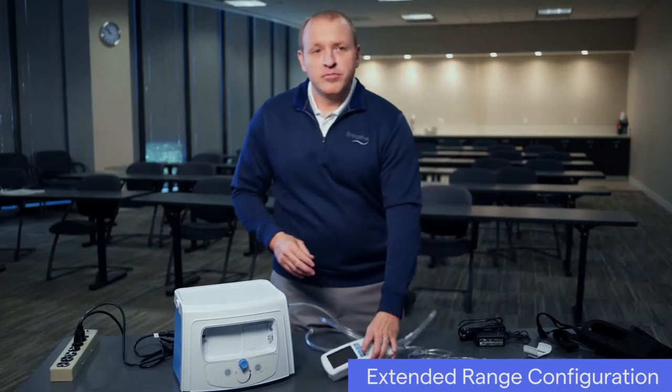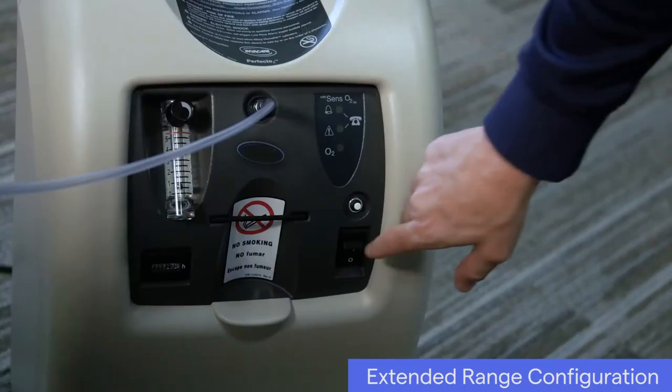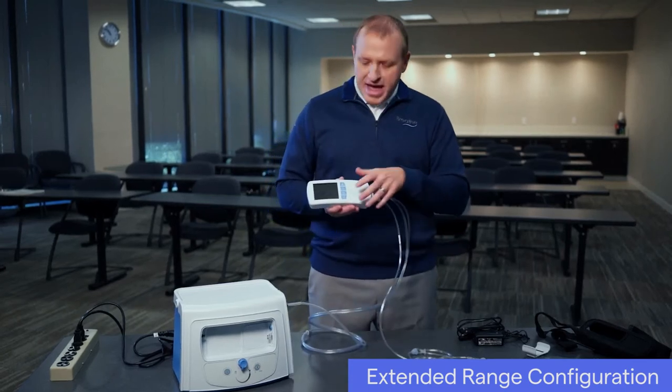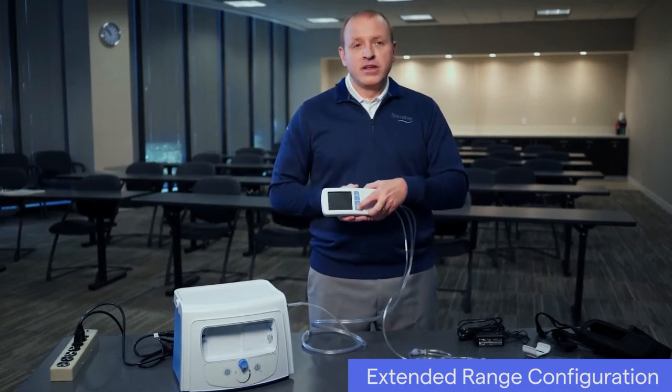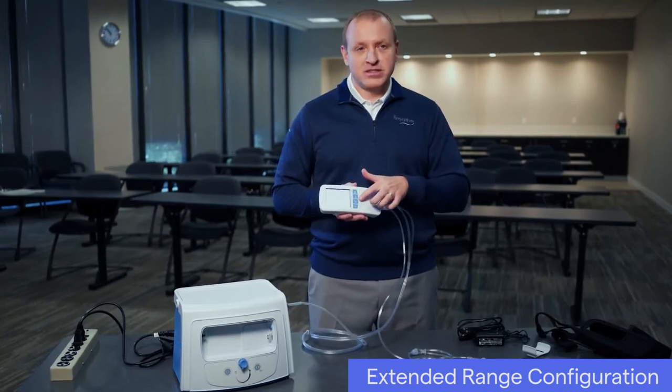Power on the compressor by pressing the power button for the compressor. If connected to an oxygen concentrator, power it on as well. Power on the ventilator by pressing the power button for the ventilator. Ventilation will begin when an activity button is pressed.